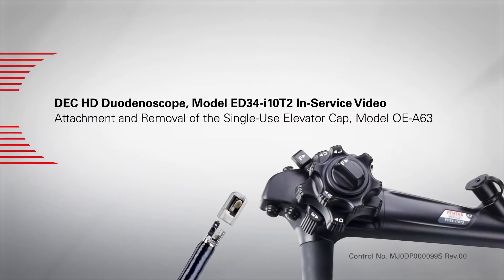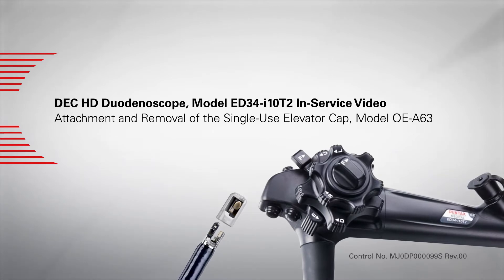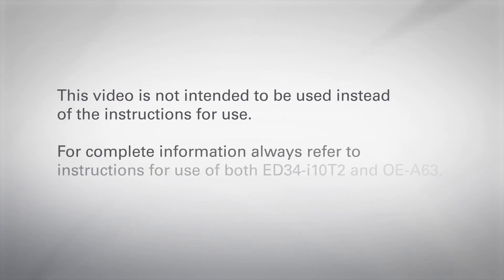In this video, we will review the proper attachment and removal of the single-use elevator cap Model OE-A63 with the DEC-HD duodenoscope Model ED34-I10-T2. This video is not intended to be used instead of the instructions for use. For complete information, always refer to instructions for use of both the ED34-I10-T2 and OE-A63.